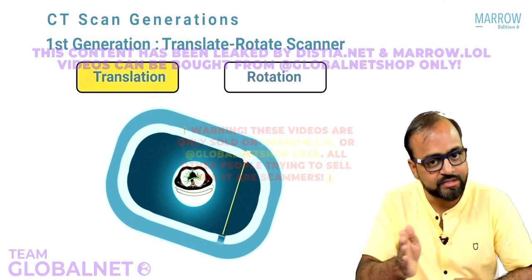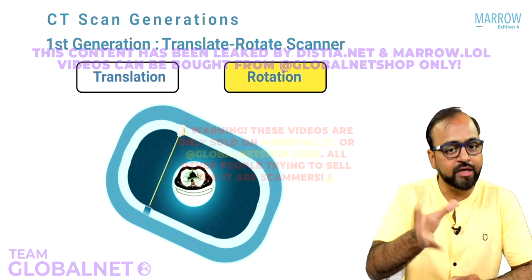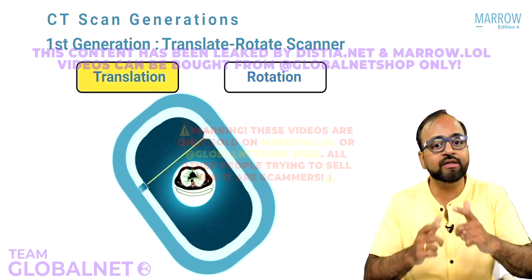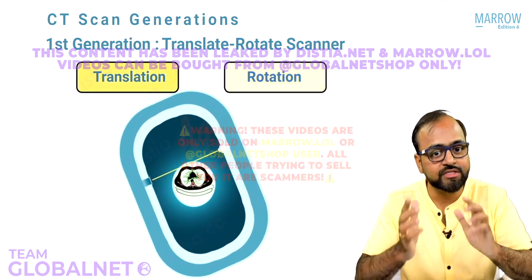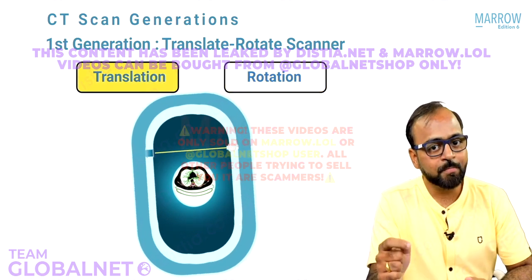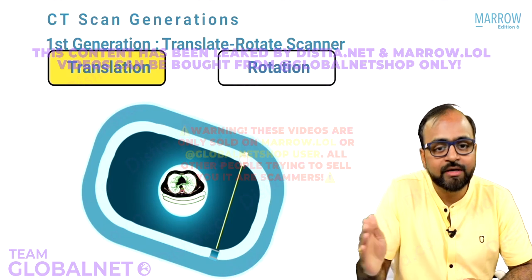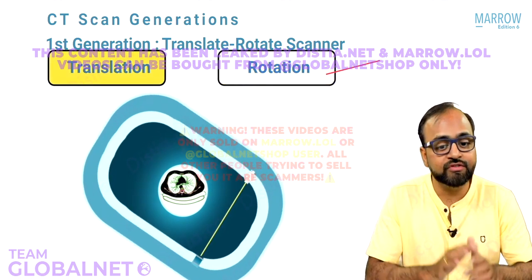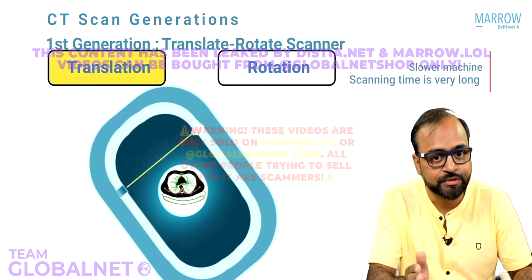You again translate, you get projection number 2. You again rotate, then you again translate, you get projection number 3. And that is how alternate translations and rotations are done. Therefore, this machine is called translate rotate scanner. You realize that because of a pencil beam, a lot of translation and rotation is required, and therefore this machine is a relatively slower working machine.